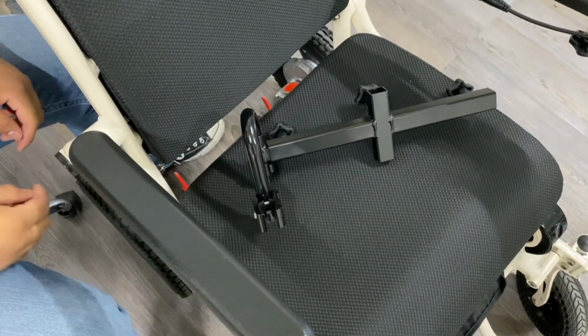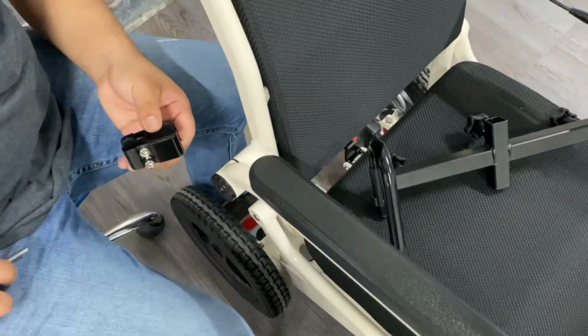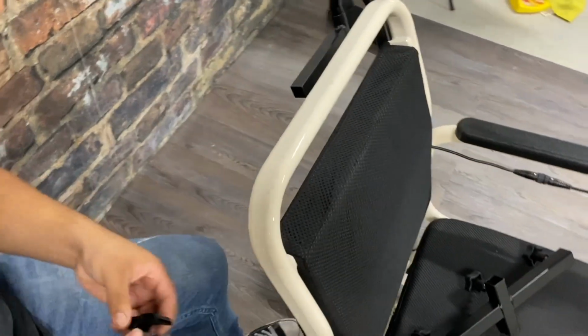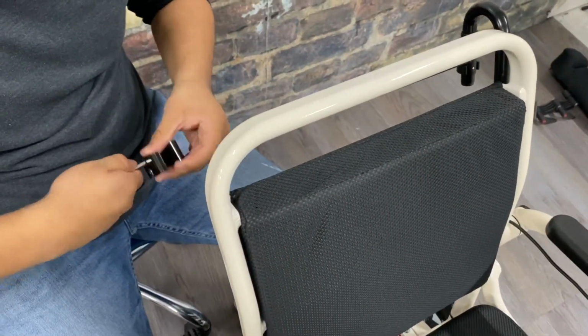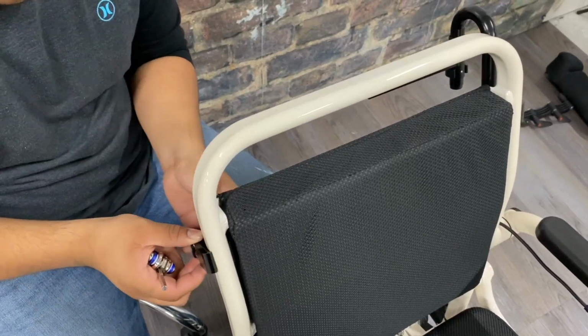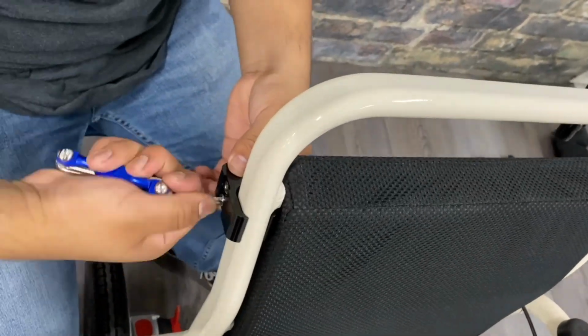Now it's time to do the other side of the chair. Remove the C-clamp from the other side of the headrest, and you're going to install it just like you did the previous side. Clamp it on to the oval frame piece of the backrest, and you're going to slide it up so that it rests against that top support bar of the backrest cushion.